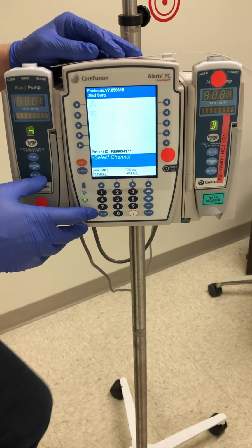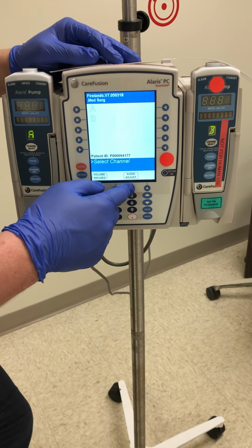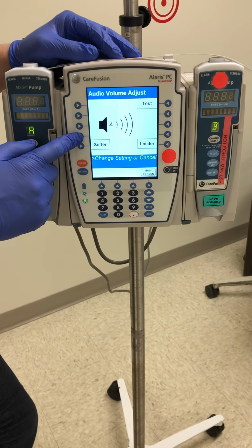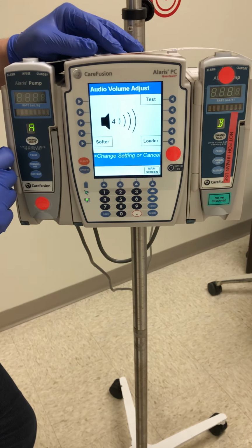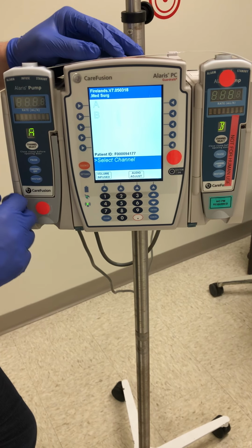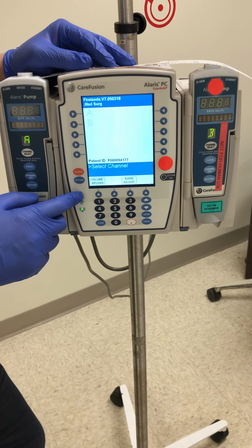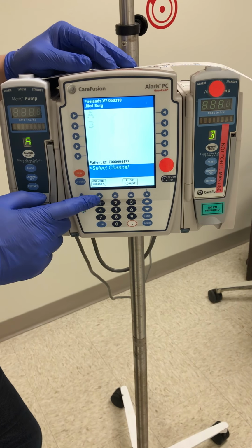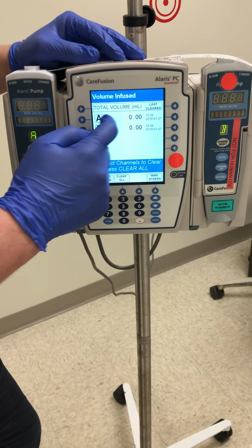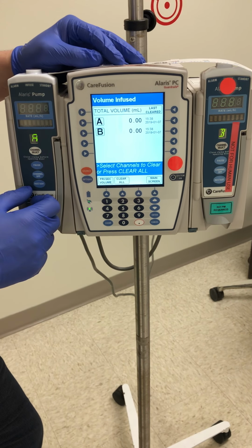This is everything that you'll need. You'll have audio adjust. So if you have a patient that is resting, you want to make sure it's not going off real loud in their ear. We can soften it a little bit. Just make sure that we're able to know as nurses when that machine is going off. Cancel and go back. We can also check the volume that has been infused. This is important for accurate intake and output, and we'll talk a little bit about this with the Meditech update with the IV flow sheet. Here you'll see it's going to show you how much of channel A has been infused and how much in channel B has been infused so that we can transmit that over into Meditech.